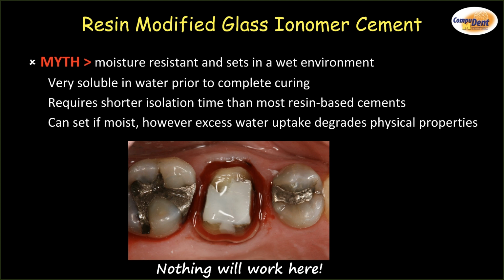No, it doesn't. You should really have the same attention to isolation and moisture control, even if you're cementing, for your restorations to work well. And that's a challenge, as we all know, in these short clinical crown situations. You're already several millimeters subgingival on the distal. Trying to keep that area dry and isolated for any length of time is a challenge.